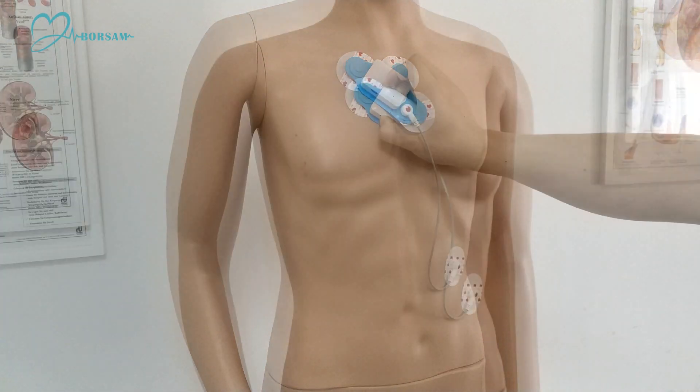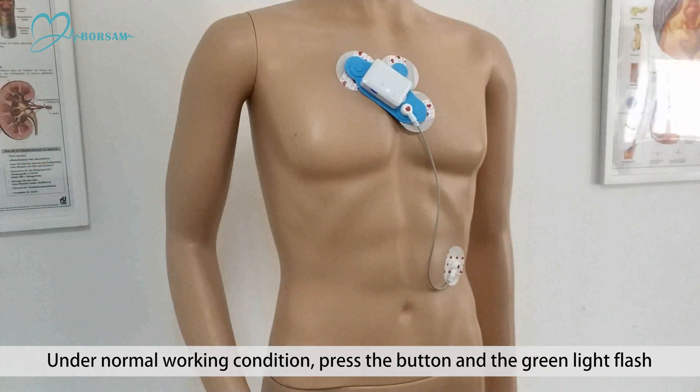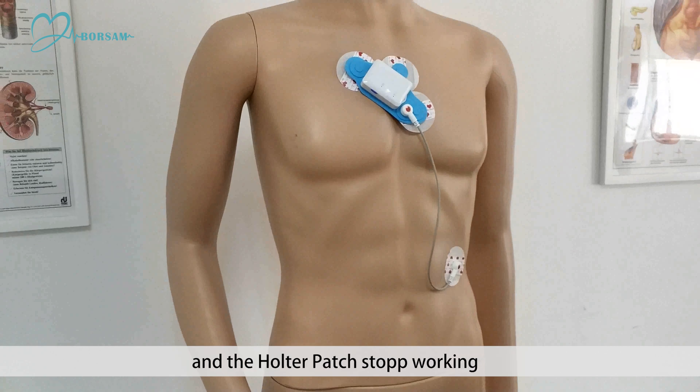ECG events mark: under normal working condition, press the button and the green light will flash, meaning it's recording. In case the light does not flash, the battery may have run out and the Holter patch has stopped working.